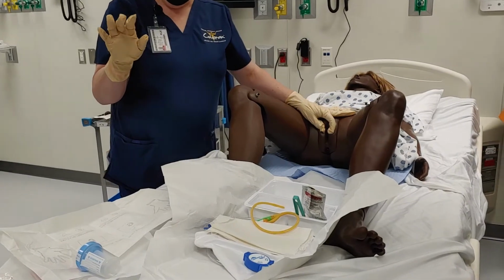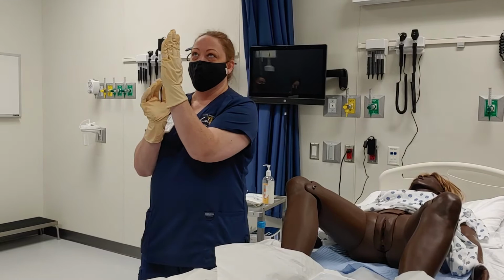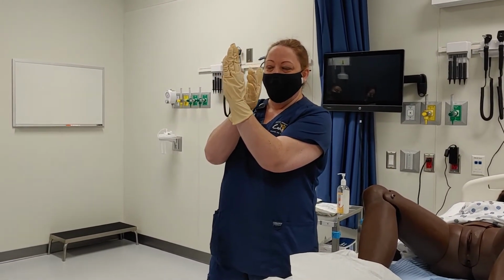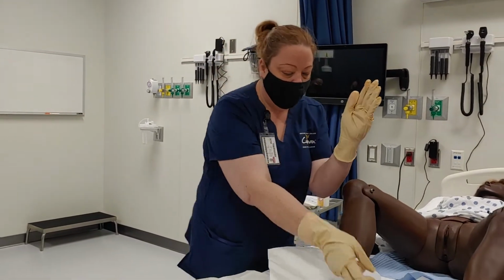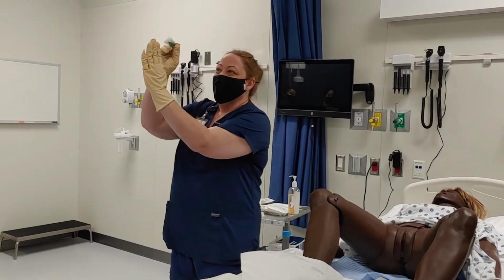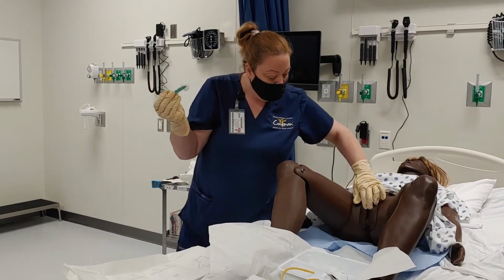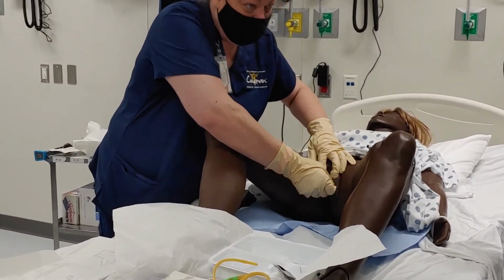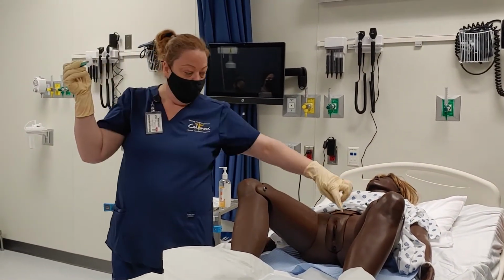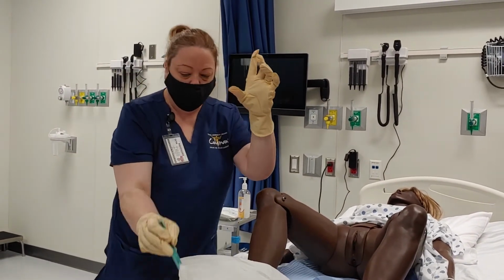The first thing that I need to do is to clean it. Now, if this is the perineal area, okay, and we've got the clitoris here and the labia off to the side, I'm going to take either the cotton swab or one of these. I'm going to wipe from the top here, on the side. I'm going to wipe down this side, okay? So if this were the opening here, I'm going to wipe from the top, this part here, down to the vagina. Get rid of that one.